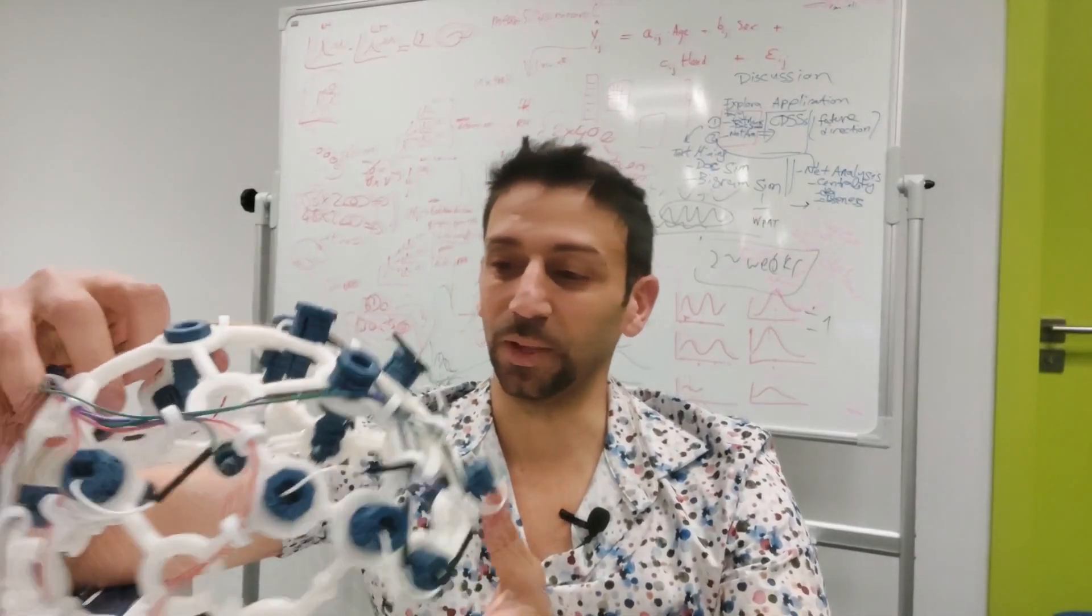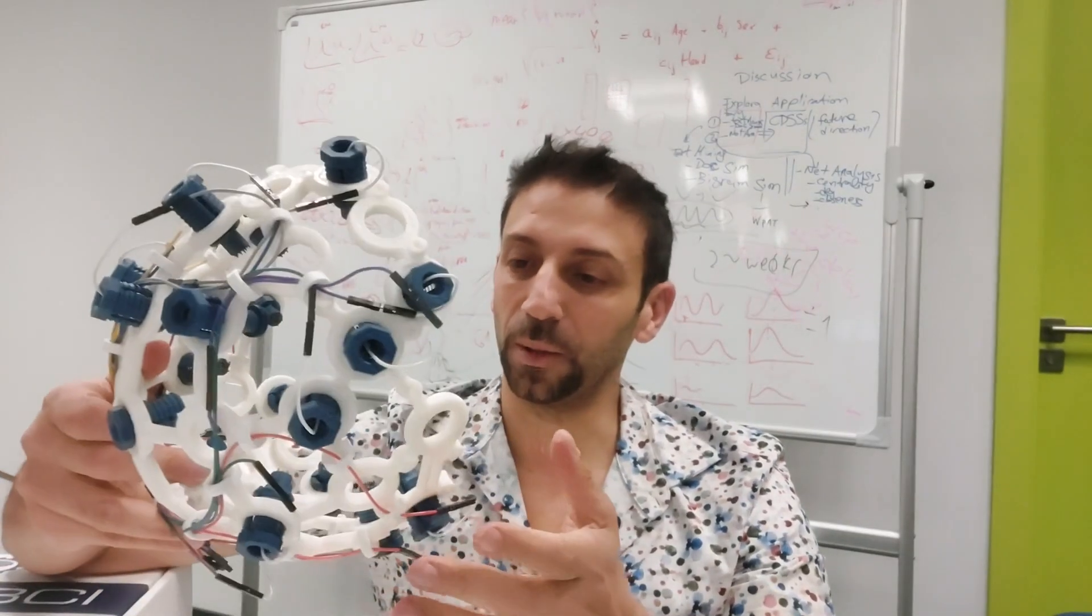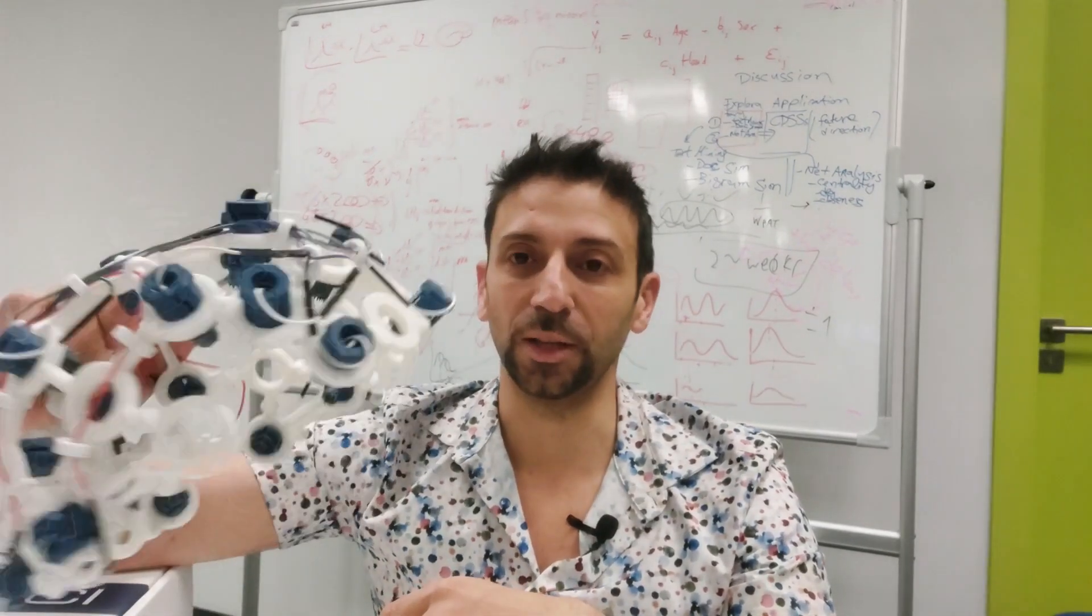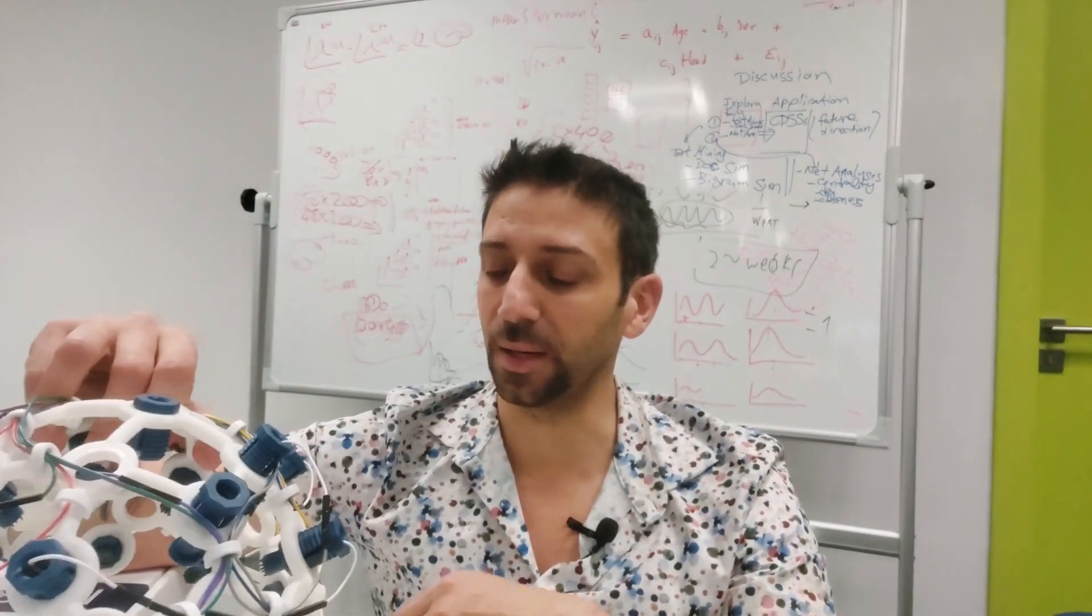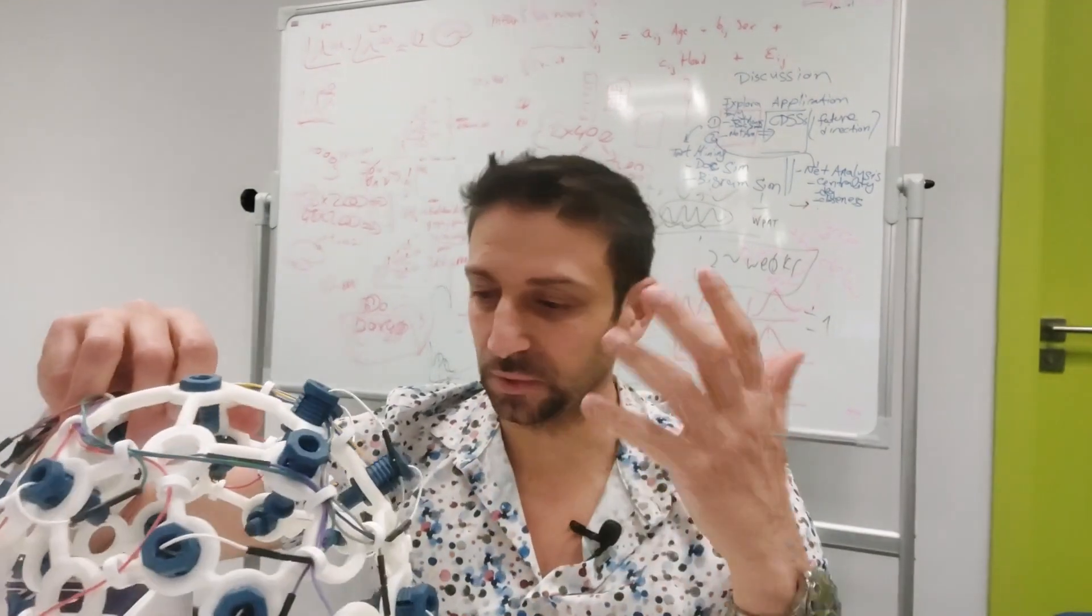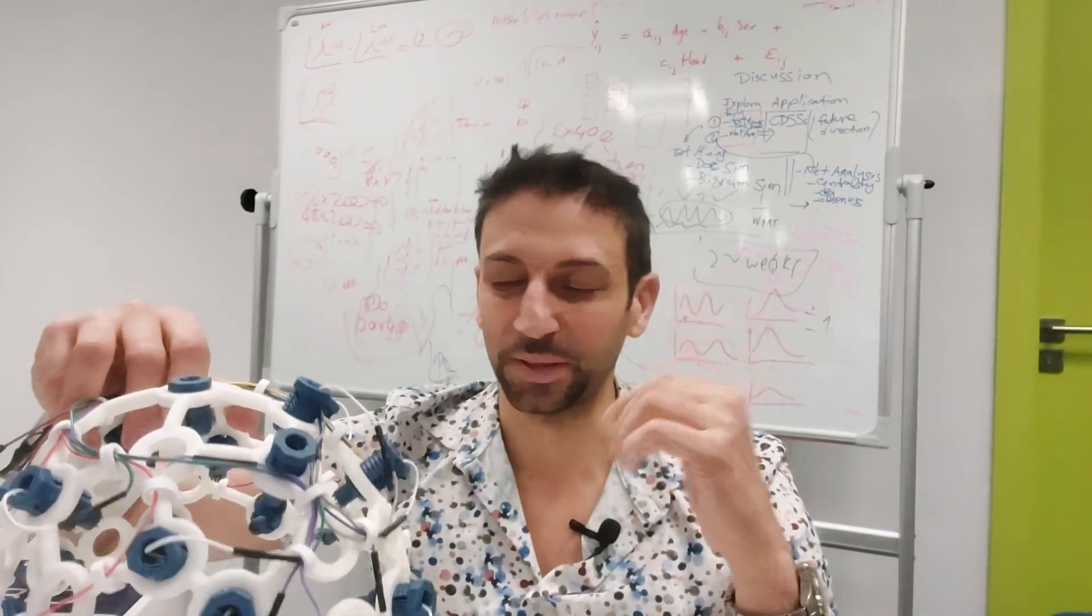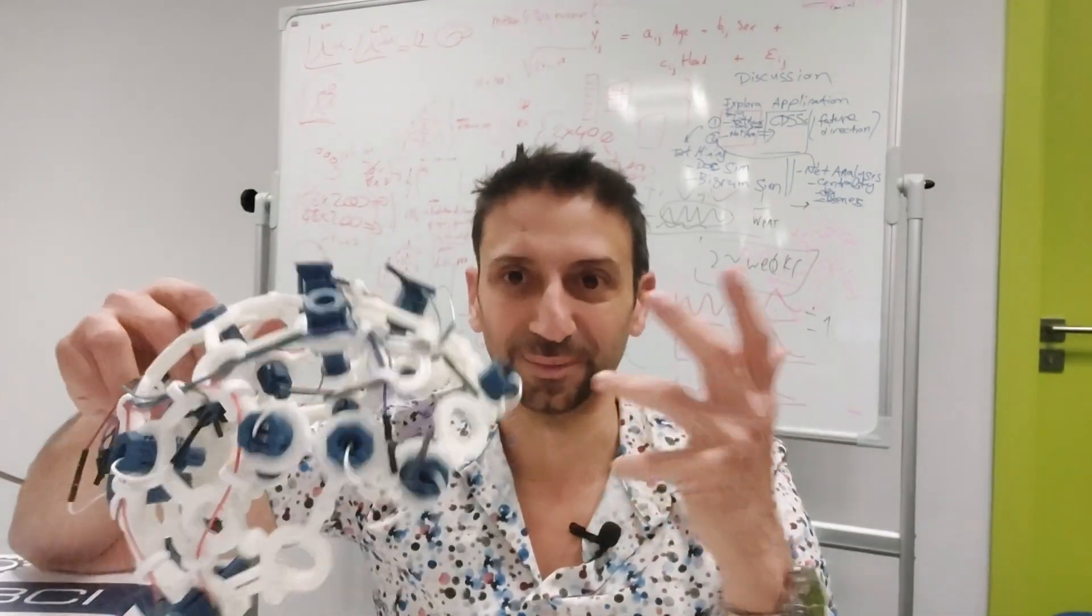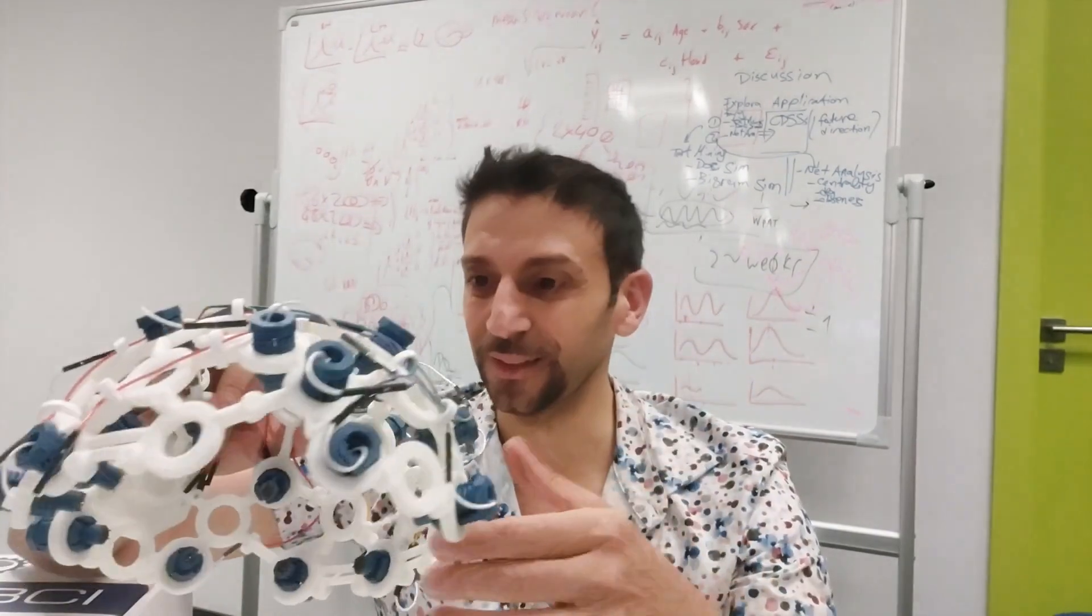Hi, welcome back. Today I'm going to show you how I'm assembling this EEG helmet which is called OpenBCI. Mostly for me to better understand, so I'm just documenting what I'm doing.